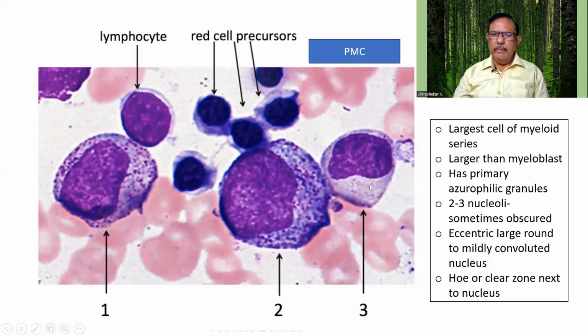This can be a myelocyte in which I am finding some granules which are secondary granules, but then the nucleoli are not very prominent. In the background, of course, I am finding uniform small cells. They are the red cell precursors. Identify a cell by the company it keeps.